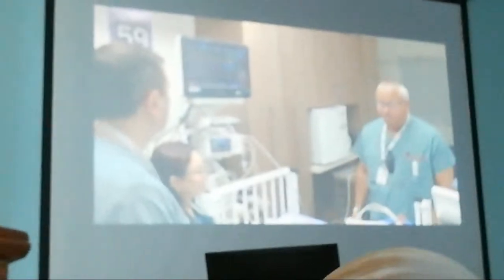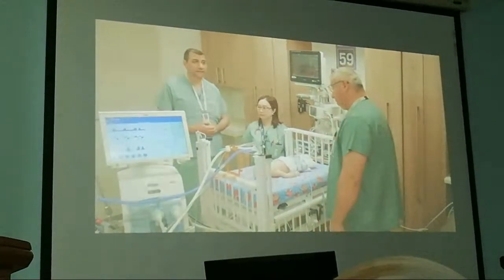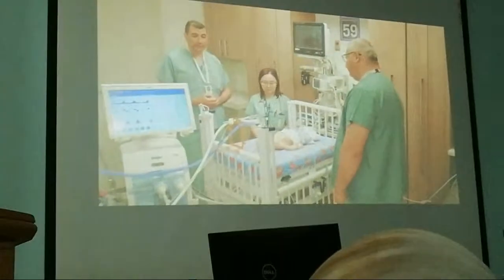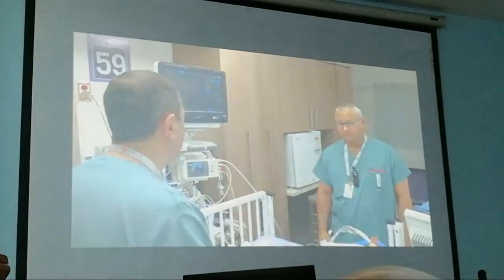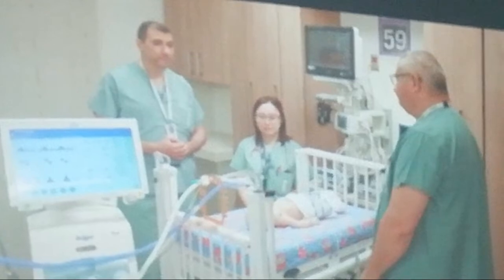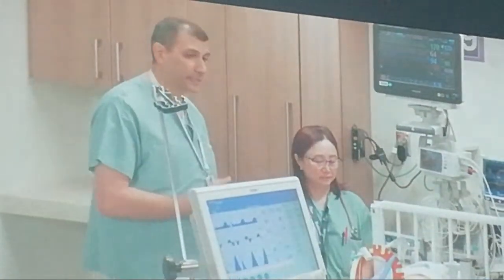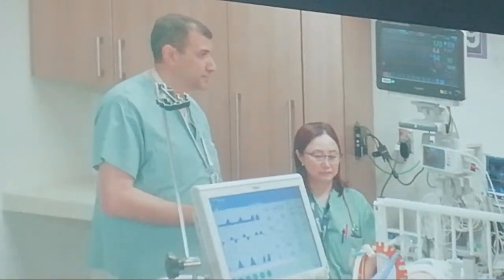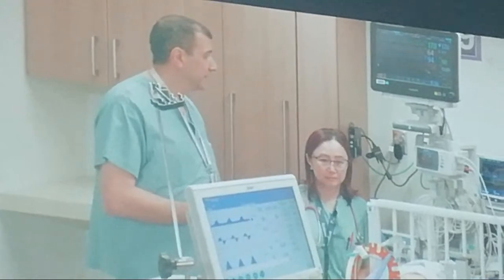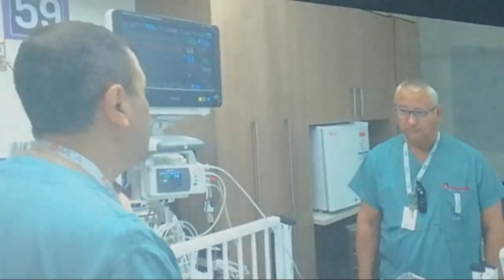So, I understand your concern. We have been on very high FiO2 for almost 1 week. And when I started to monitor the body oximetry, including the brain and somatic oxygen extraction, it is very low. So I calculated the brain oxygen extraction based on the arterial oxygen saturation and the near-infrared spectroscopy reading, and it was just 0.04.